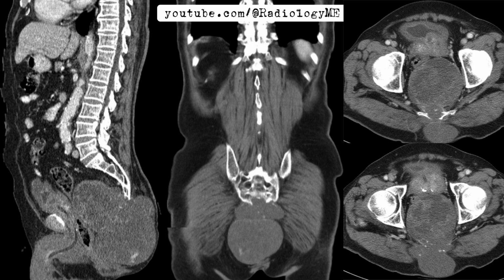The patient will need full local and distant staging, and once surgery is planned, the goal is to remove the tumor with clear margins to reduce recurrence risk. Post-surgery, photon beam radiation might be considered if the tumor resection isn't clean. This case really underscores the importance of imaging in identifying and guiding treatment for such aggressive lesions.